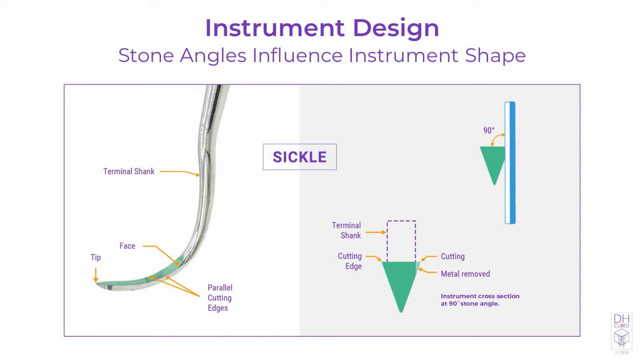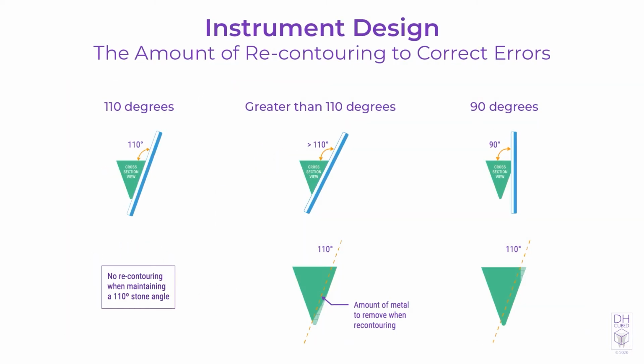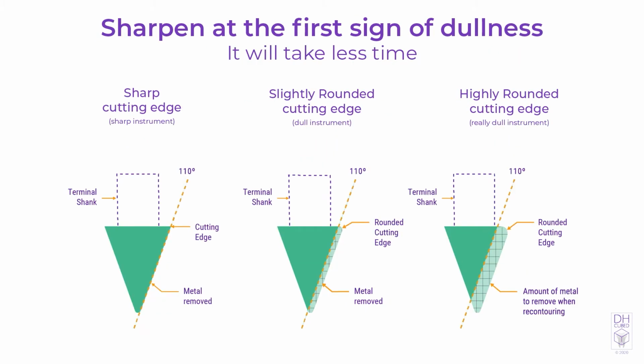Over time, this repeated action can result in hand or wrist pain and injury. When sharpened incorrectly, look at the amount of metal that has to be removed in order to get back to the original design. If the instrument is allowed to get too dull, the cutting edge gets very rounded. This rounded cutting edge will not bite the tooth surface and engage the piece of calculus, resulting in burnished calculus.